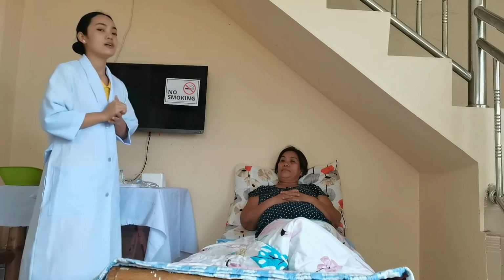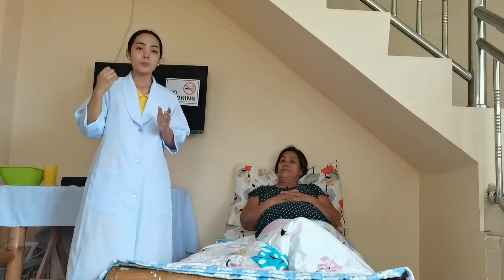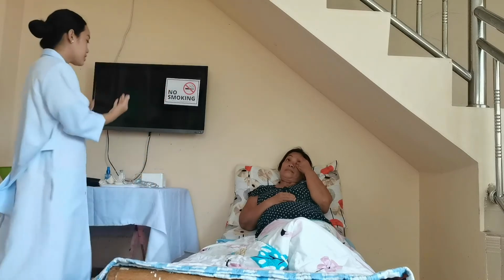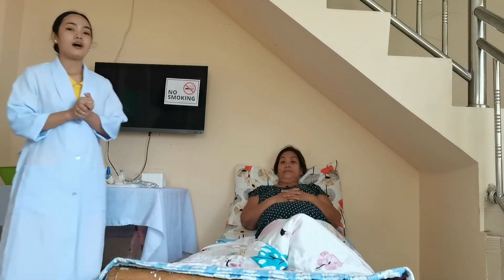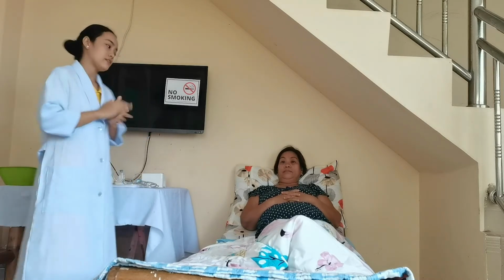Alright po, that's good. So, after doing that, we will now gather the needed materials. So, I have gathered here my materials in the bedside table, and then perform hand hygiene and put on PPE if needed.